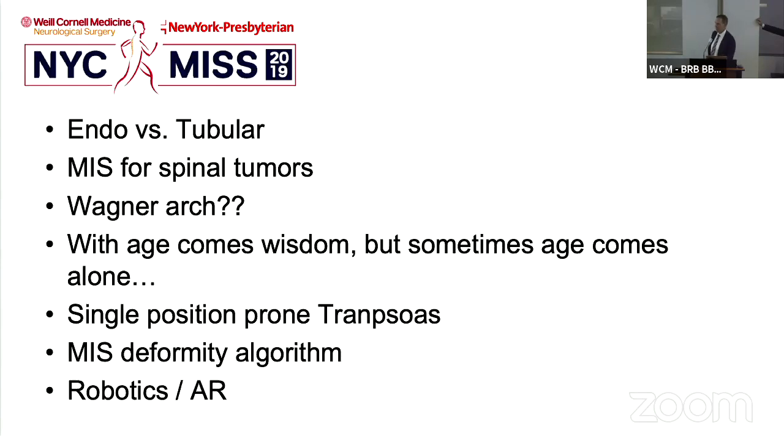With the advancement of the technology, we will see that we're going to use it for complex tumor surgeries. Today, we can merge the CT, MRI, and PET scans all together and see the environment of the tumor. So I believe that within 2 to 5 years, we can easily use it for tumor surgery. This is just the starting point, putting a screw with the augmented reality.